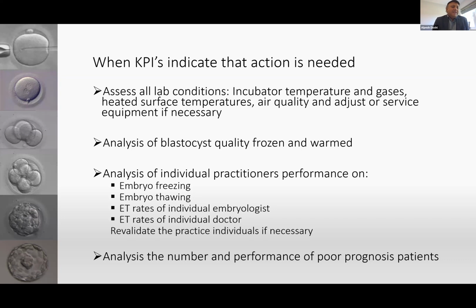Are you getting more BC embryos from the laboratory? Again, it's quite important to do that audit and assessment when things are not working. Above all, you would also start wanting to question individual practitioners. And I can tell you, having led a team of 16 embryologists myself in a very, very busy clinic, it used to be a case whereby all I used to do was troubleshooting.